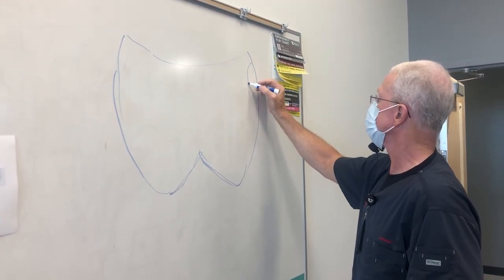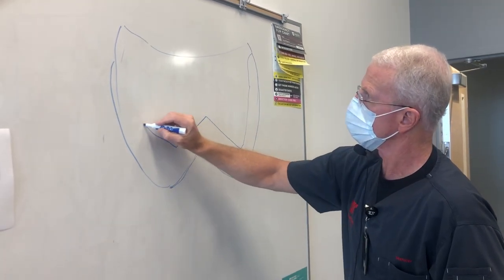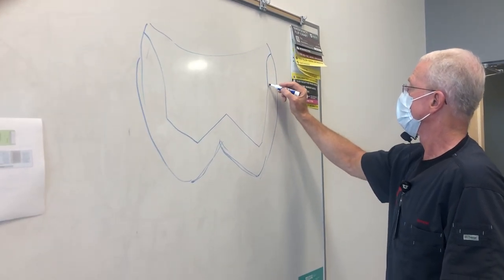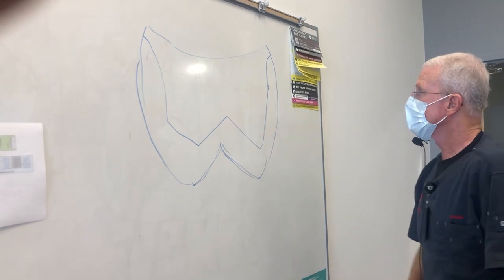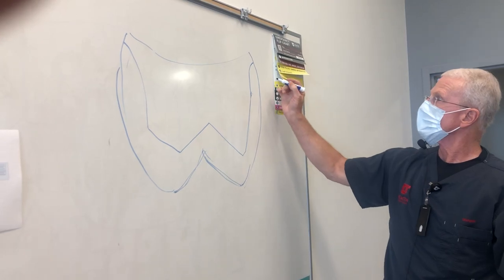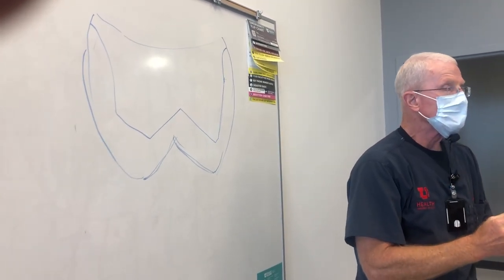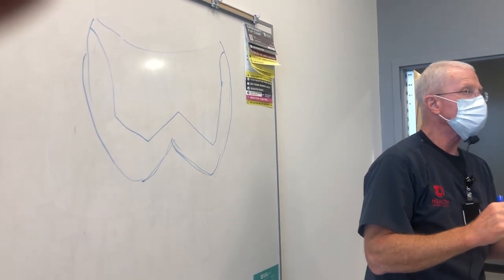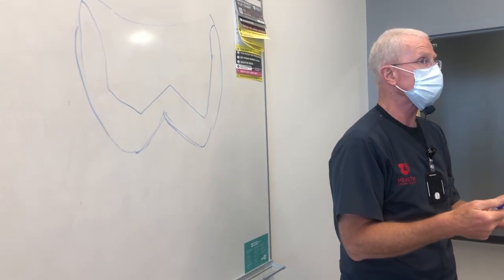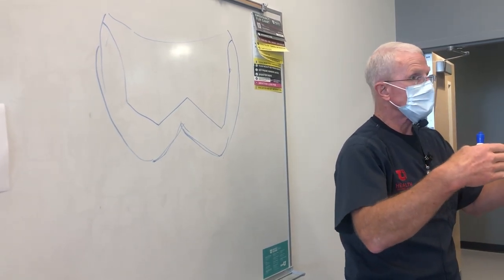Let's do our chamfer with the two plane. Something like that. So a couple of things happen with a chamfer. One is you cut away your reference points. So unless you do a preoperative putty matrix, which you can do, and in fact when you take the board exam, that's what you do, so that the examiners can assess your preparation.